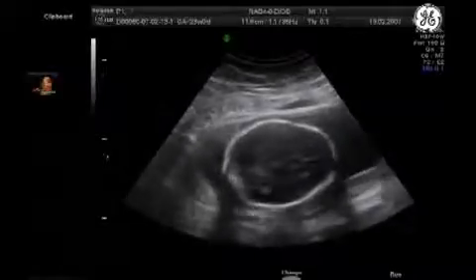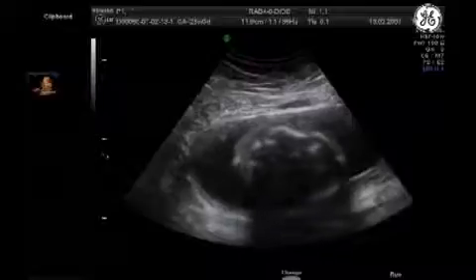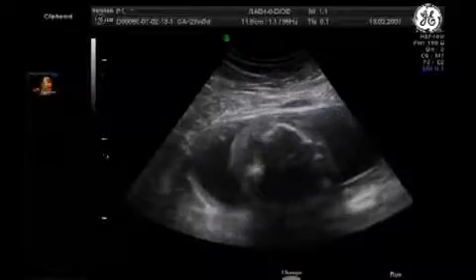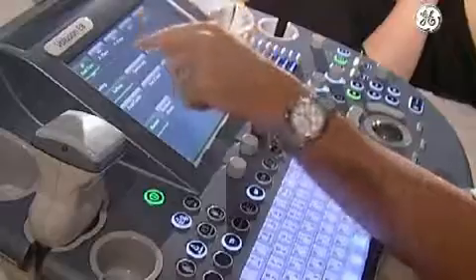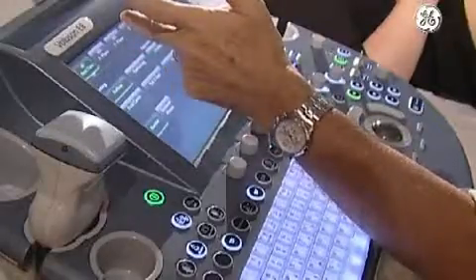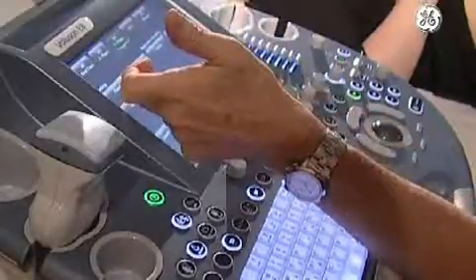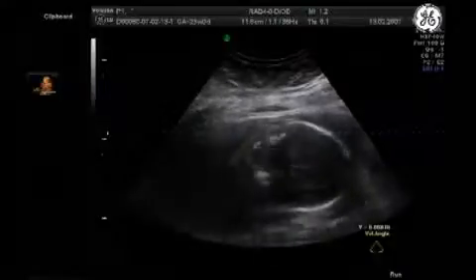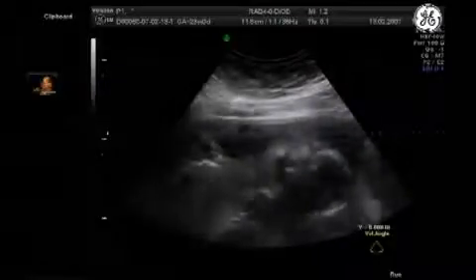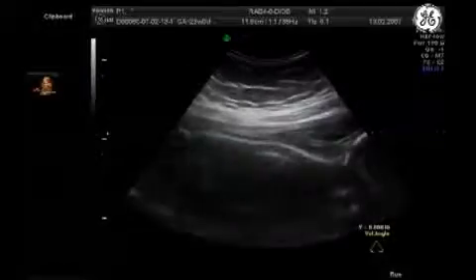This is the use of the surface mode. We can use the transparency mode, but for this I prefer to use the VCI static here. VCI, not static, VCI C plane with bone. I will do it on the spine, it's okay.